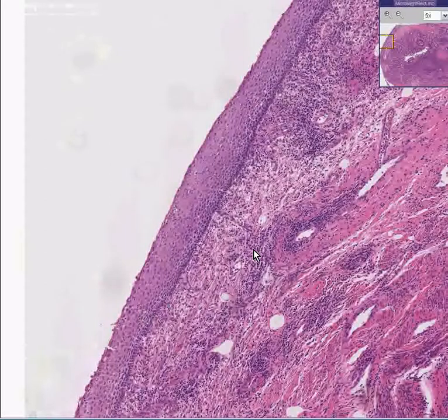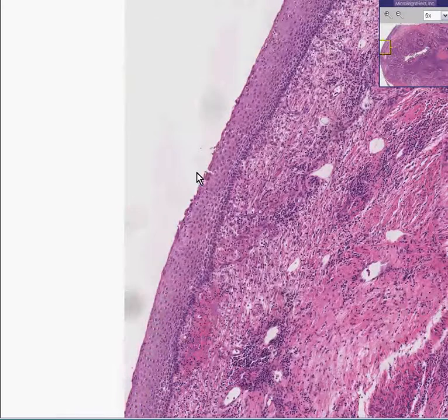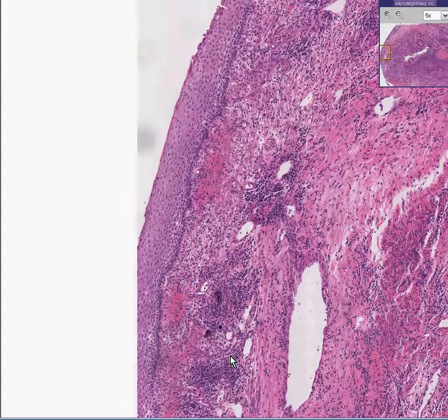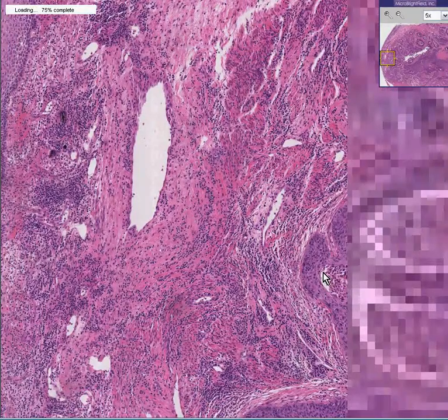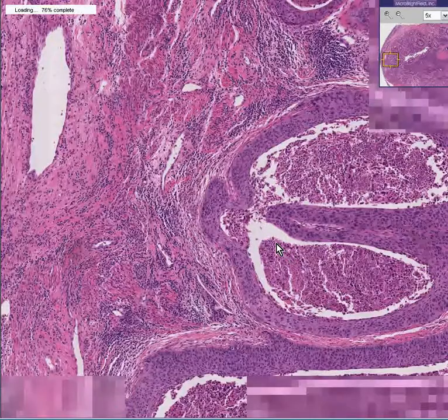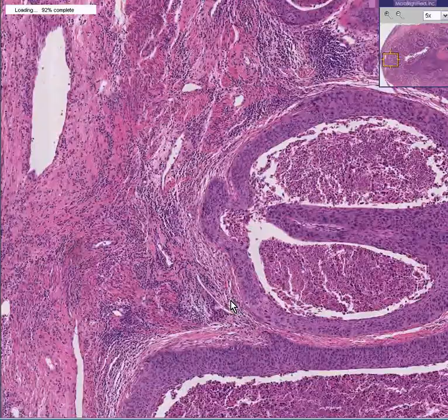So if you follow this relatively normal but inflamed and maybe HPV infected squamous epithelium out, there's more inflammation underneath it. And eventually you'll be running into stuff which doesn't look like pure old inflammation anymore, does it? It looks like when you look underneath this inflamed squamous mucosa, you see some more squamous nests, but they don't at all look normal and orderly like we saw before. This is infiltrating squamous cell cancer again.